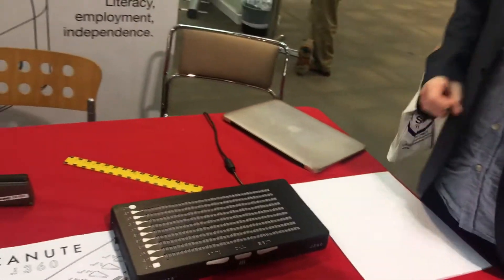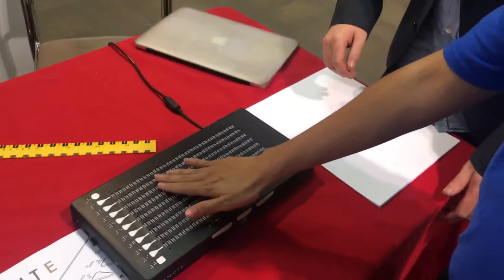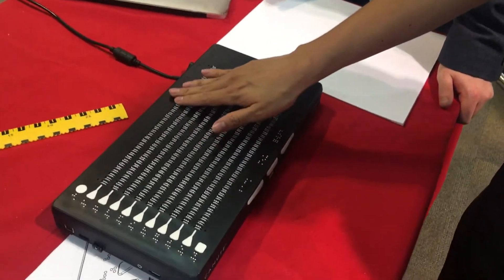We're currently making and selling the Canute, which is the world's first multi-line braille. On the table in front of me is the Canute 360, which is a 9-line, 360-cell braille e-reader.